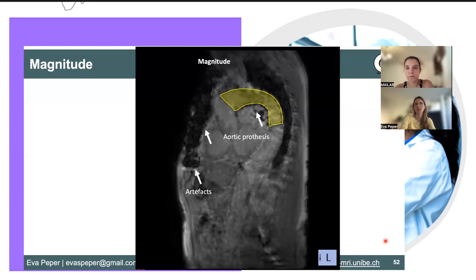I also did low field flow scans, and it was also possible. If you have less SNR, so less signal, that makes your phase noisier in turn. So your velocity estimation will be noisier or less accurate. And that is, of course, a problem. You can compensate for it like you can in any sequence. So you can again choose a larger voxel size, for example, but it will lead to the problems I also mentioned earlier. A larger voxel size will then not solve this problem.